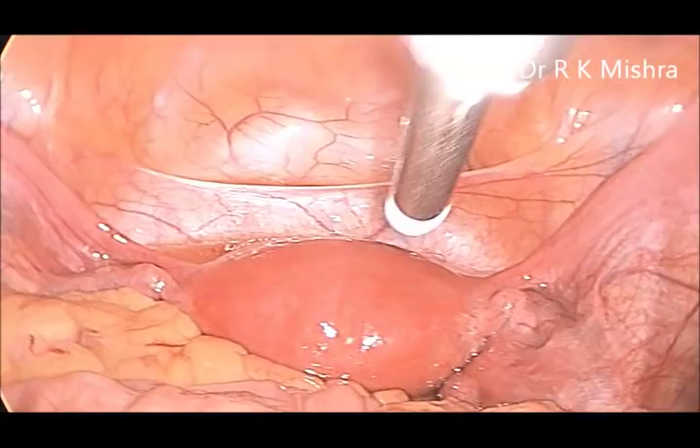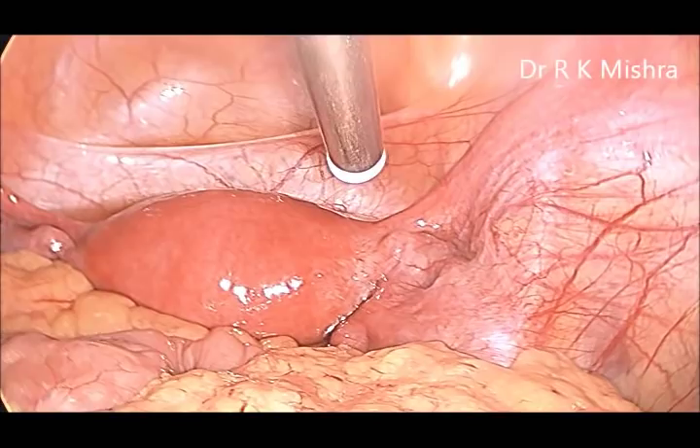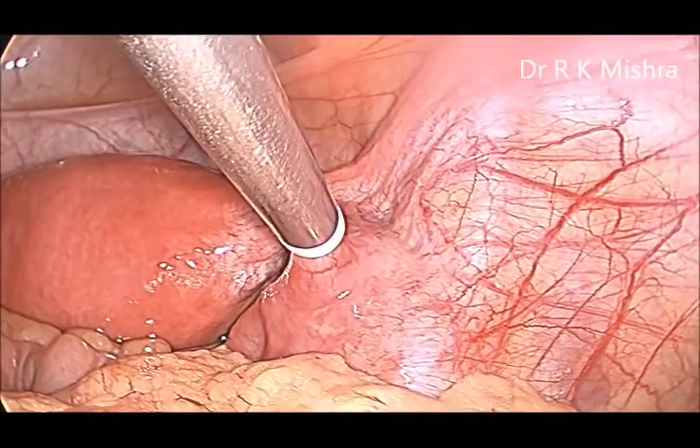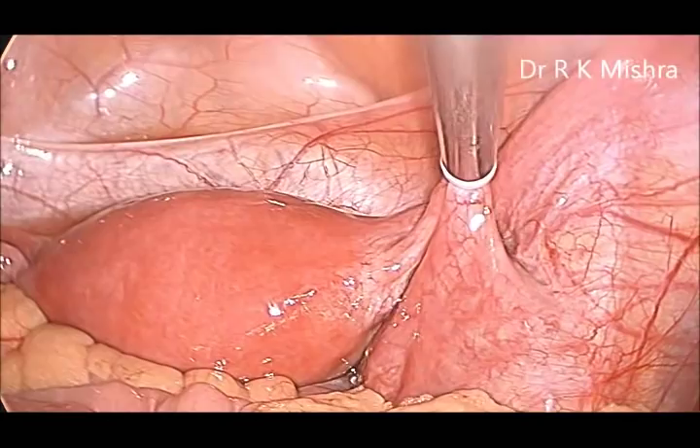Hi, this is a case of laparoscopic sterilization where we have used the fallop ring applicator. It is a one-port approach, with the port placed halfway in between the umbilicus and pubic symphysis — not completely suprapubic. Here, this is the isthmus of the tube and the fallop ring has just been applied.